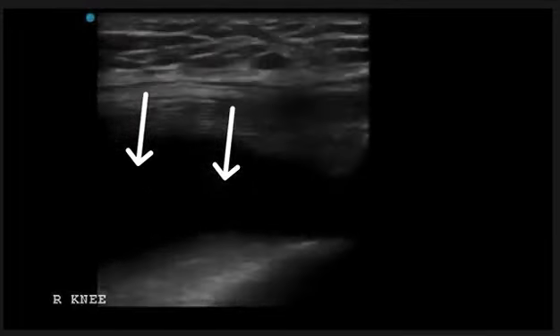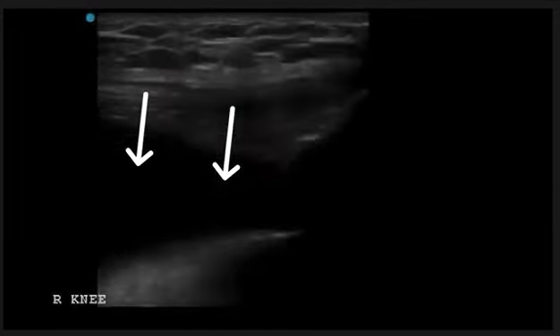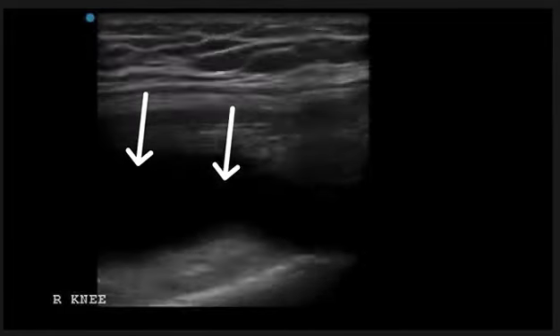Here is what a knee effusion looks like on the suprapatellar view. There's black fluid under the quad tendon and above the femur. I've had a few times that this spot actually had an easier pocket to drain than the medial or lateral views.